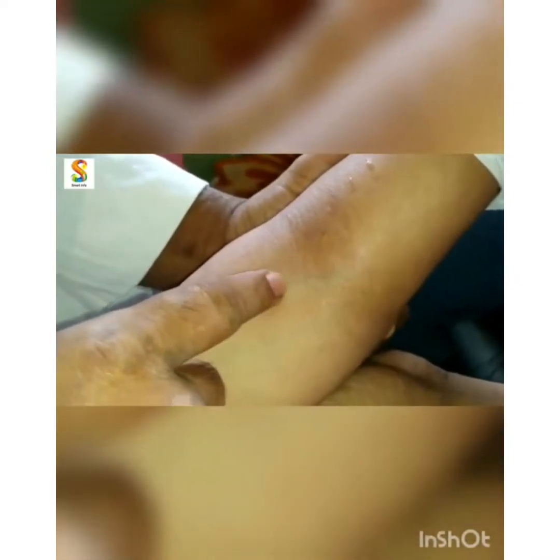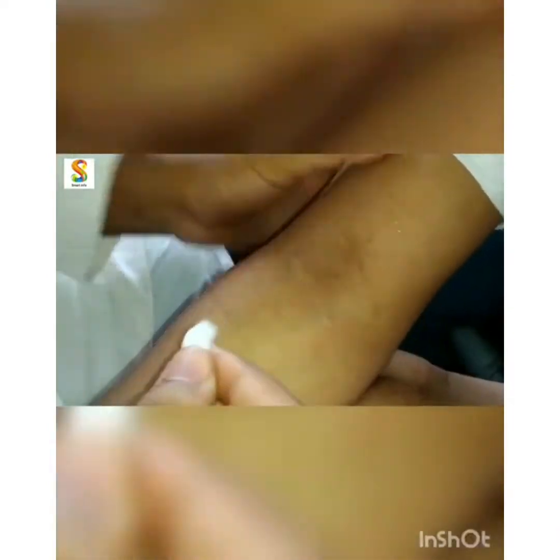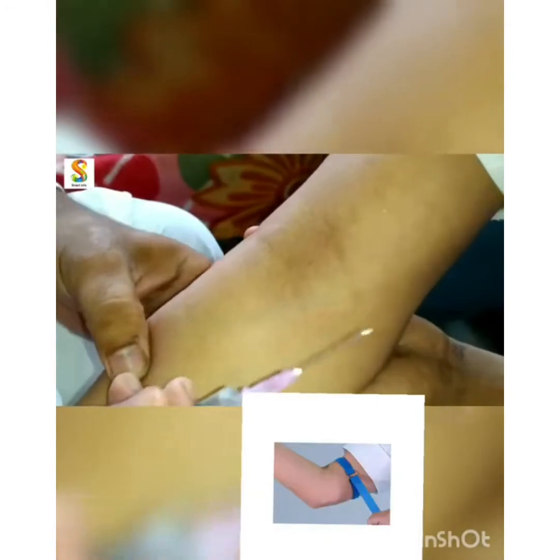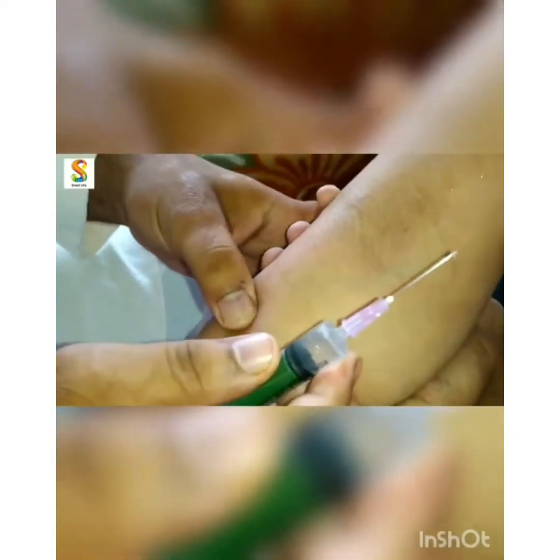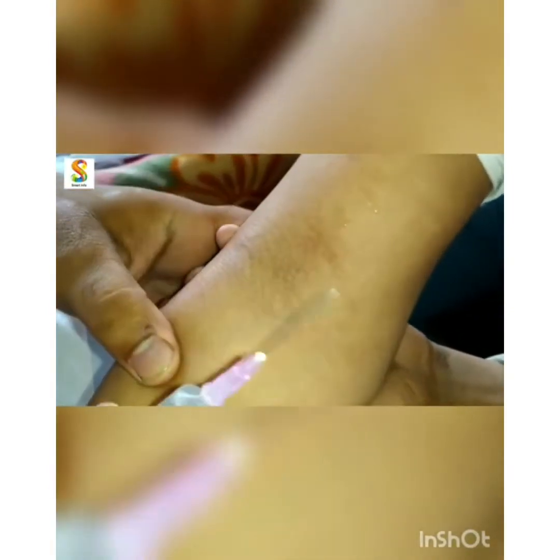Here you can see there is a vein that's very much prominent. So if a person does not have a prominent vein there, we can use what's called a tourniquet. But this person has a vein that is very much prominent here. Now all we need to do is insert the needle in a proper way into this vein, as you can see, into this vein. You can feel it like this. Now we need to insert this syringe into this vein.